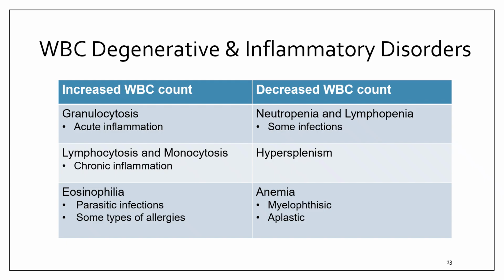On a peripheral smear, you may see increased segmented neutrophils, a possible left shift, and some band forms. You may also see toxic granulation in severe inflammation. This is the classic bacterial infection smear. Neutrophils are the ER nurses of the immune world, first on scene, loud, messy, and very effective.